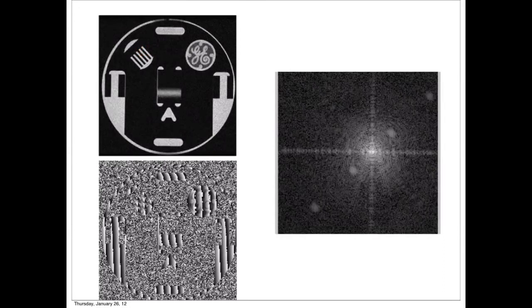Yeah. So if I collected more of K space, I might have seen another one here, another one here, another one here. Oh, okay. Keep on going.